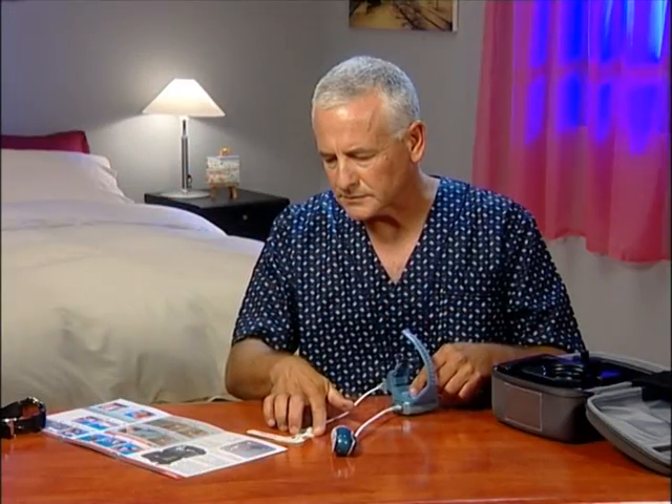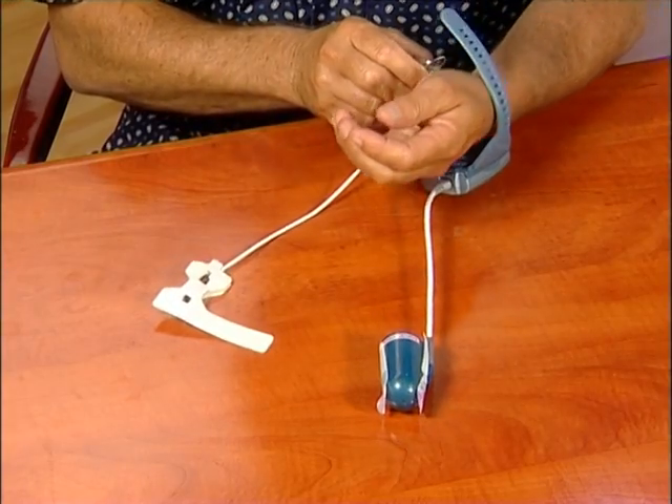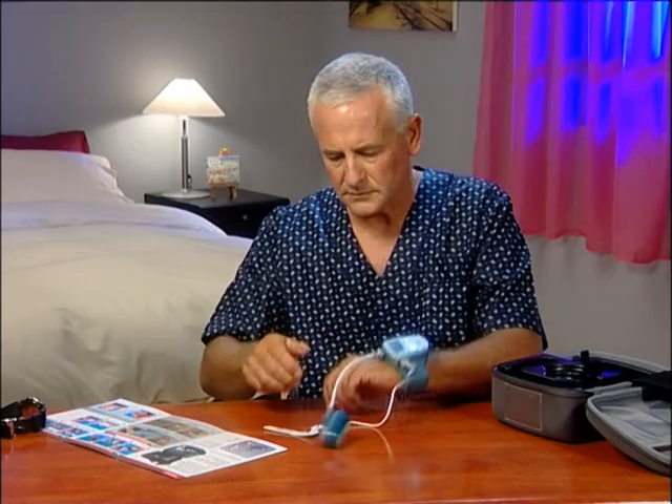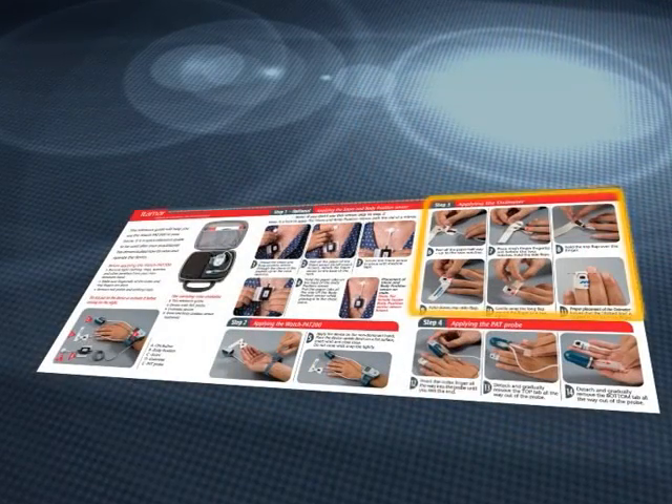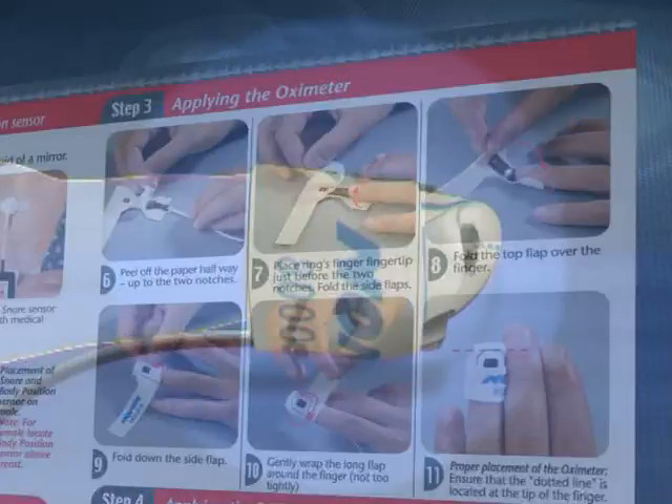Place the WatchPat on a flat surface. Insert your hand and close the wrist strap. Make sure it's snug but not too tight. Follow the illustrated instructions to correctly attach the oximeter sensor.